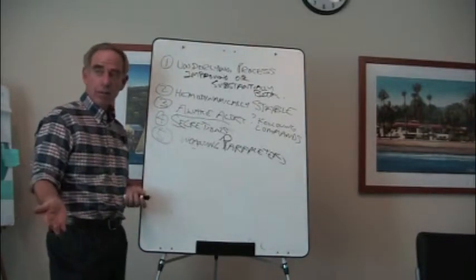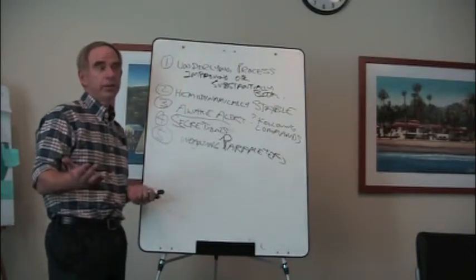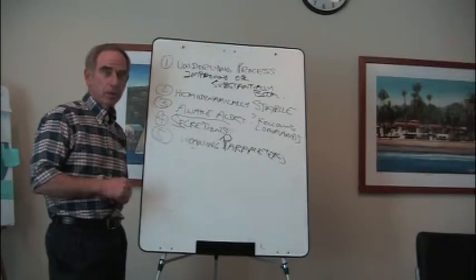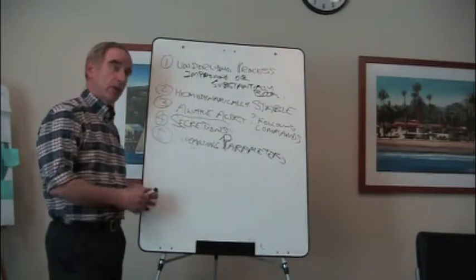Likewise, when we look at vital capacity, that tells you something about your patient. What does that tell you? Does that correlate with anything? We talked about how you do a vital capacity measurement. You said, breathe all the way in. Take a really big breath in and blow it out as hard and fast as you can.